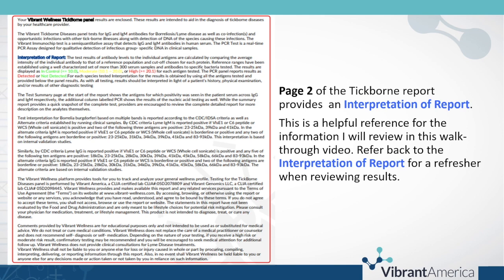When you first receive your panel, on page 2 you will notice this interpretation of report text block. It is very tempting to scroll right past this page and not pay attention to it. I do urge you to use this page as a very helpful reference. All the information that I am going to go over today in this walkthrough video is on this page, and you can refer back to it when you are reviewing your results.